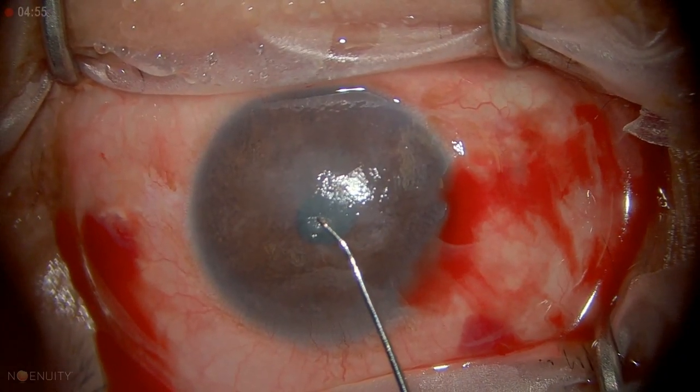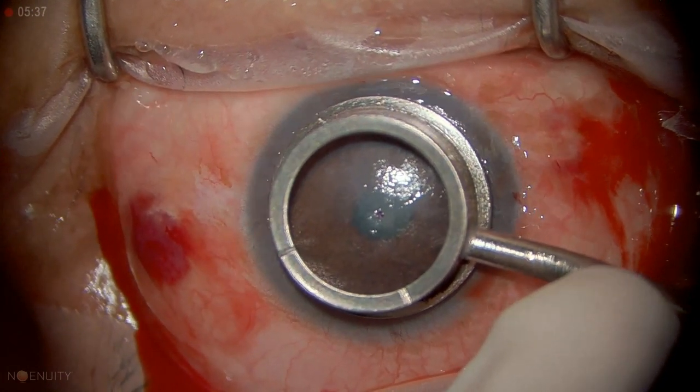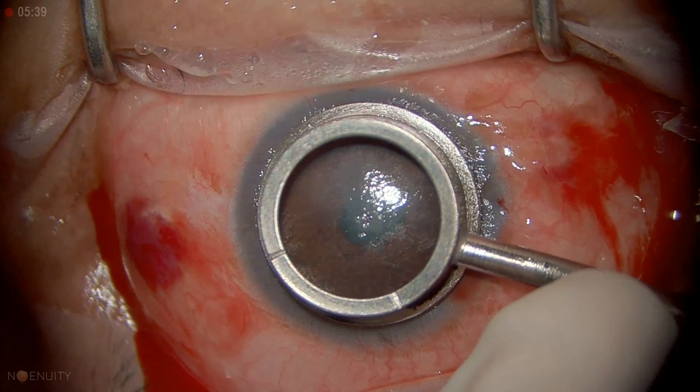I'm just marking the center of the cornea. I'll take that optical zone marker — so that's eight millimeters. We're going to do a 7.5 graft, so we're going to go inside of that.